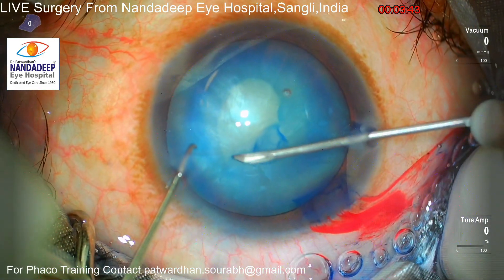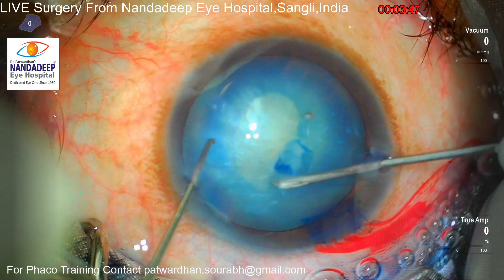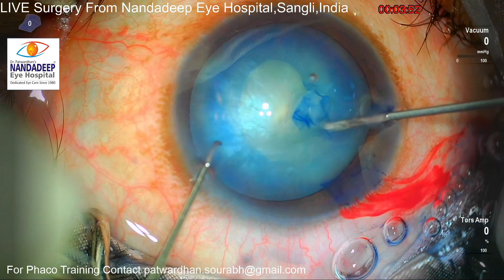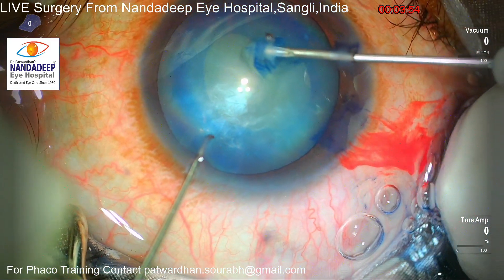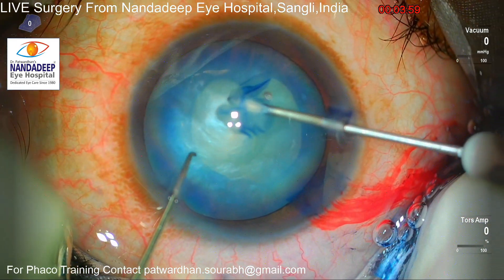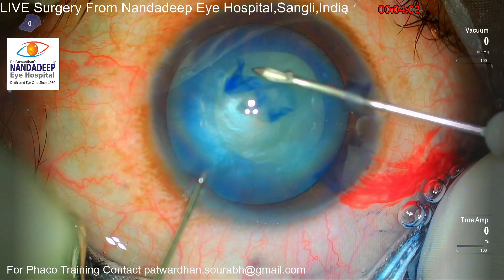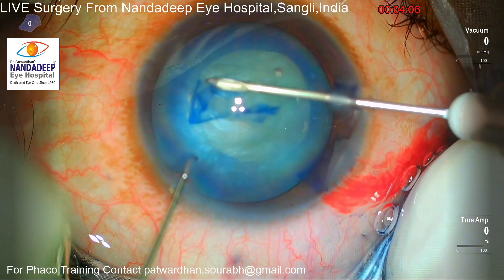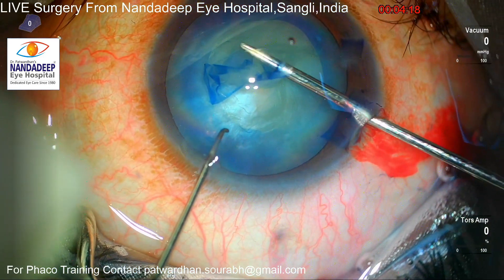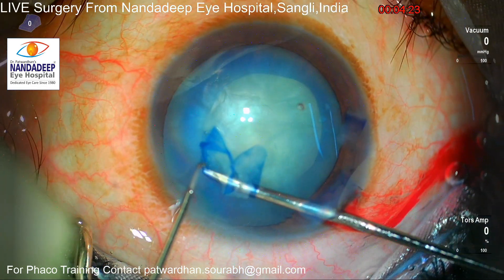Of course with explained prognosis, because I don't know how the retina is in this particular patient. The idea during capsulorhexis is to use a good heavy OVD so that there is no extension of the CCC. I am trying to go around these fibrotic bands very carefully, and if there is any resistance at the fibrotic band I want to use the forceps.